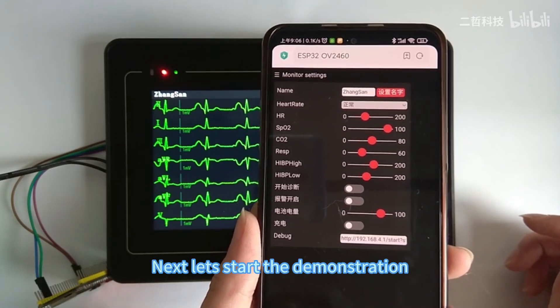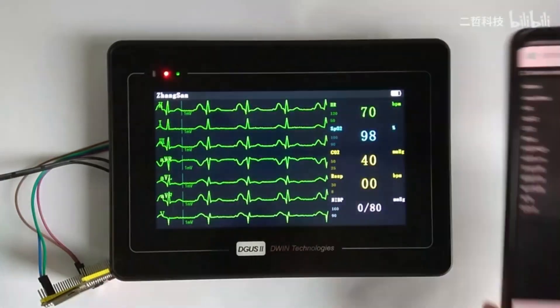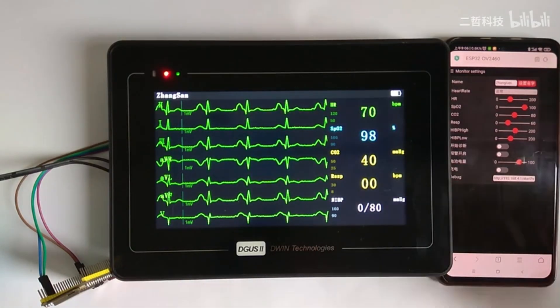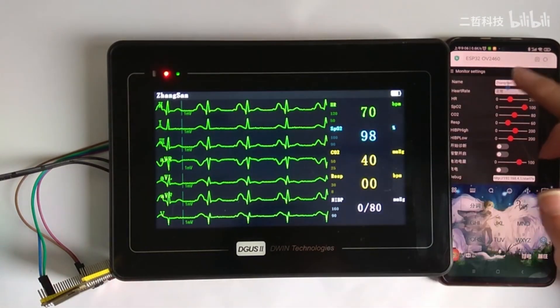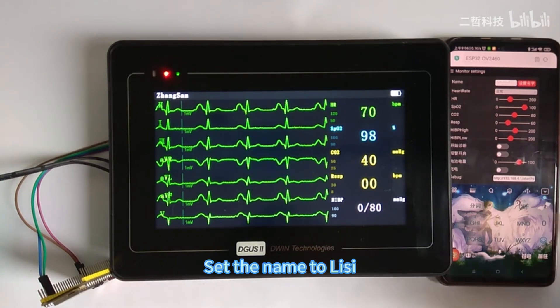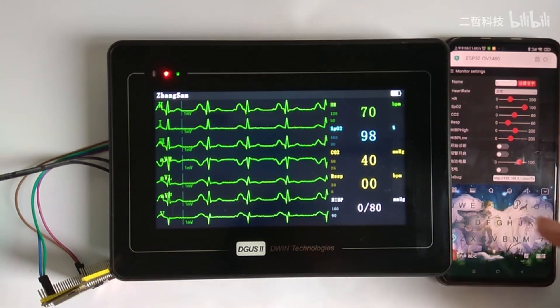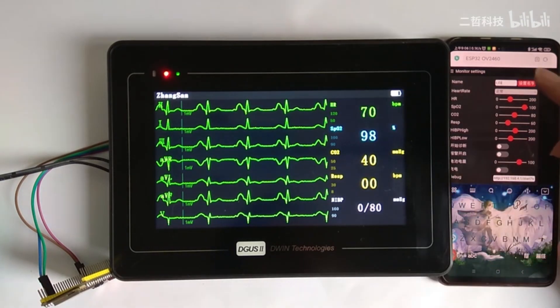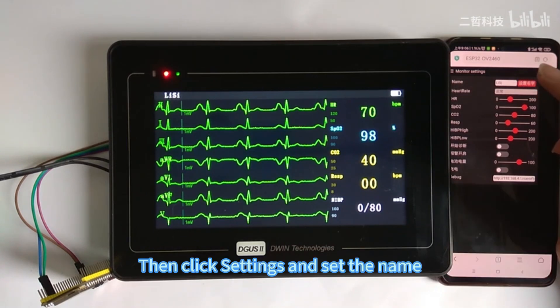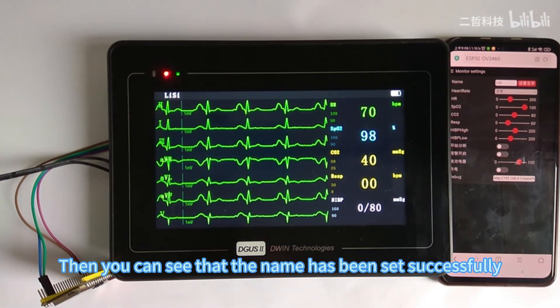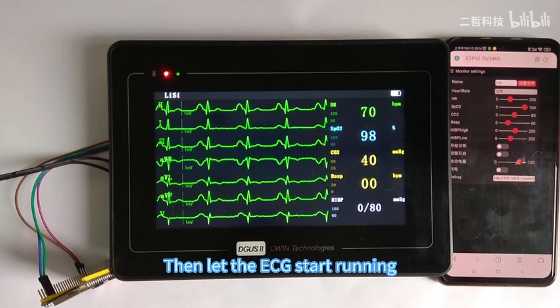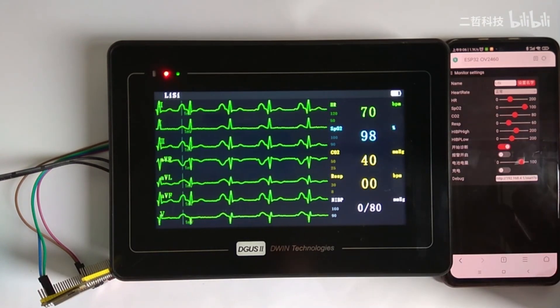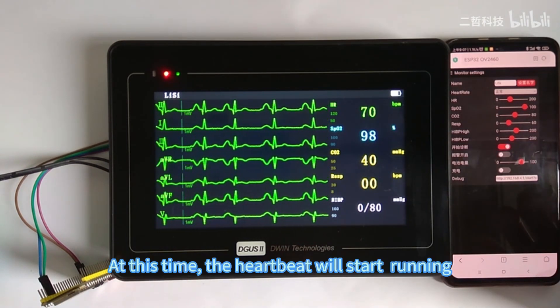Next, let's start the demonstration. First, we set the username — set the name to Leazy. Then click settings and apply the name. You can see that the name has been set successfully. Now let the ECG start running by clicking to start diagnosis. At this point, the heartbeat waveform will start running.